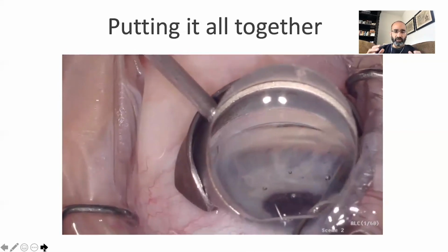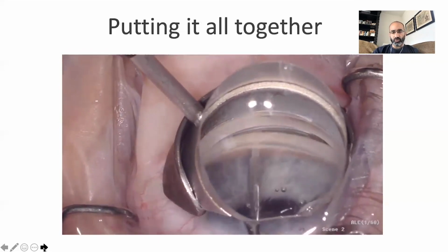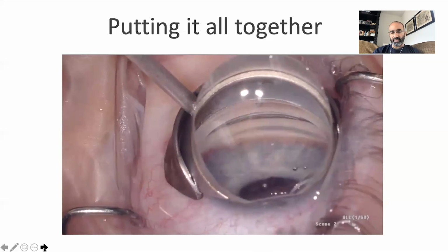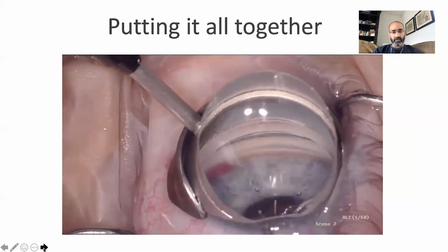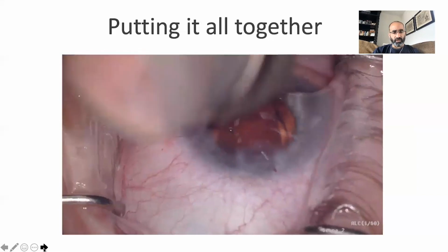And then right to left, you could zoom in a little bit more so that you're a little bit more focused on the trabecular meshwork, something that you should do when you're first starting out. But you get an idea of the stability. There's not a lot of wasted movement, very deliberate in the movements that he's doing. And then he goes in with Duet forceps and pulls the strip of trabecular meshwork off of the iris, and all done with the case. So it gives you an idea of what the technique should look like once you've refined it.